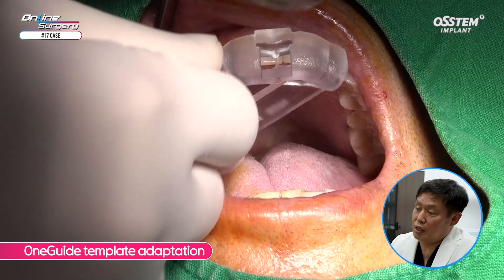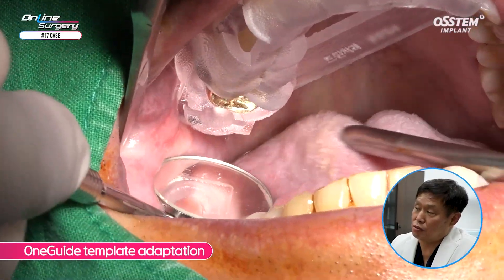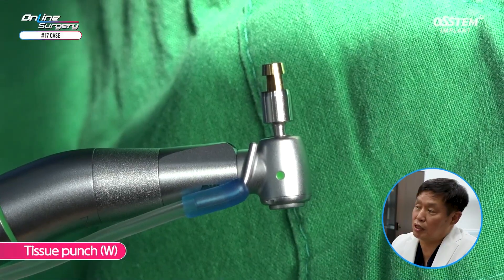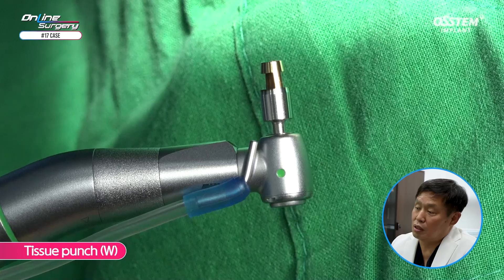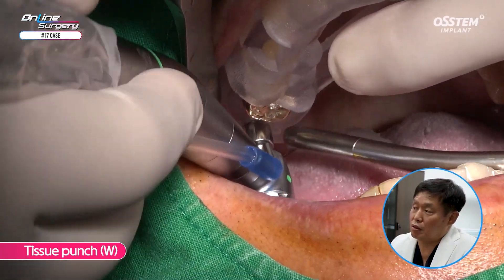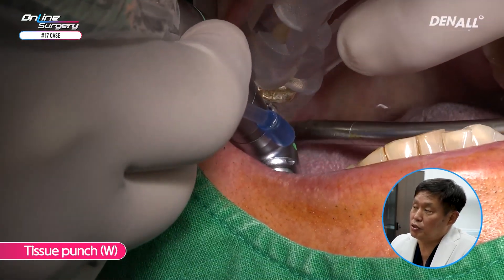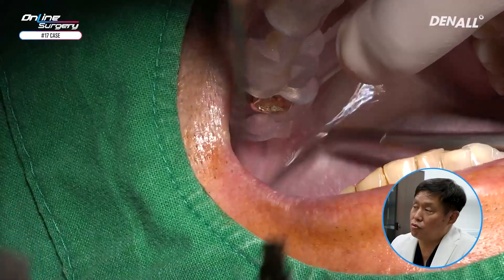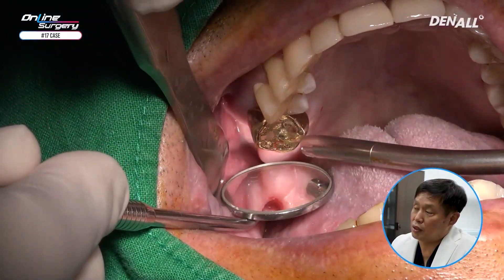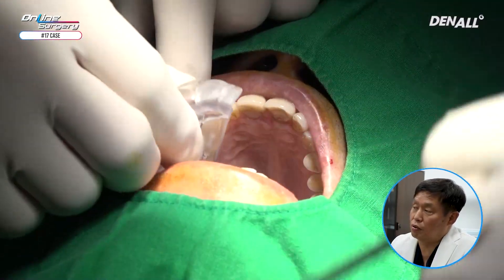One Guide template adaptation was done as shown. Mirrors and other tools were used to check the position of the One Guide template. A tissue punch was used to remove the overriding mucosa. You can see that the template was fixed with my hand. After removal was confirmed, the One Guide template was positioned once again.